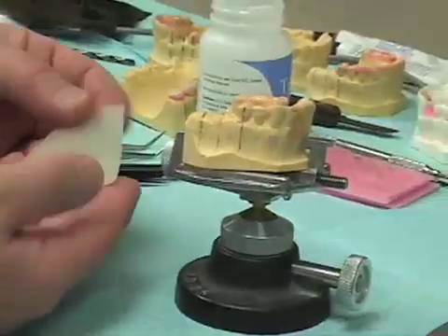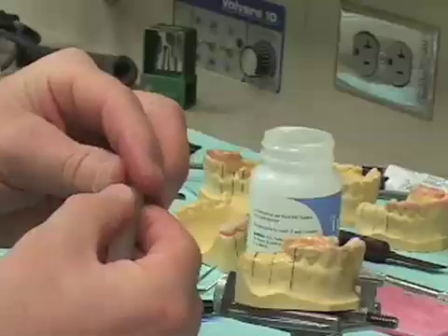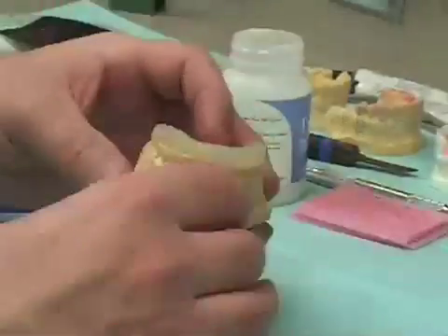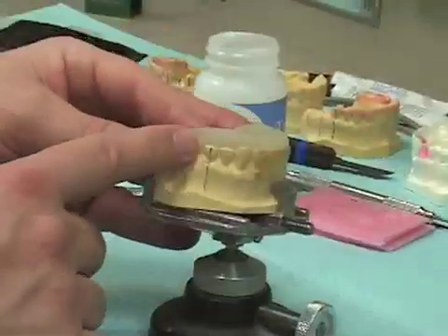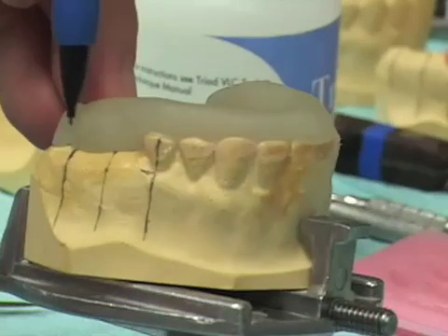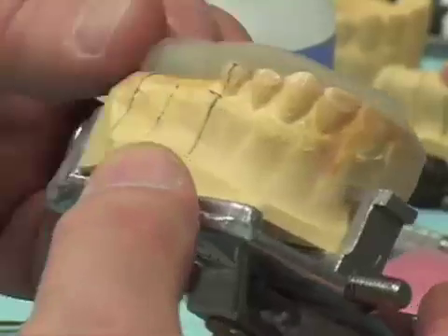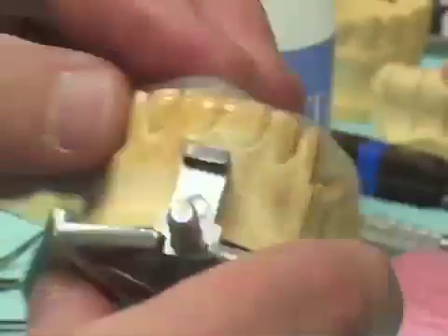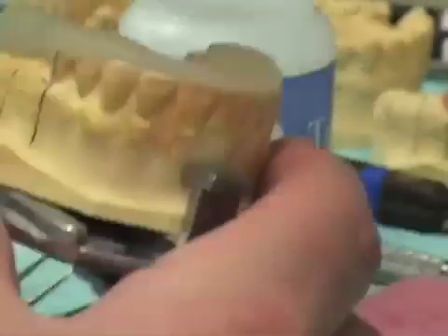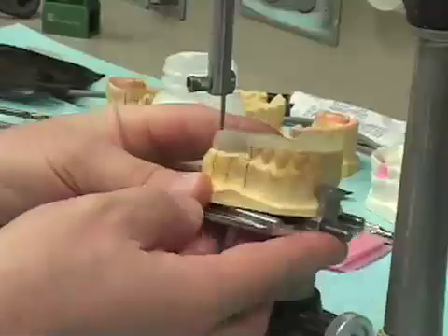With the triad material, I fold it and then literally roll it in my hands making an oblong rope. I then place it on the occlusal surfaces and orient it so that it comes far enough back to go past the area where I want to place both implants. I press the triad down on the occlusal and incisal surfaces of my model — not trying to wrap it over the buccal or incisals. I then bring my surveyor in, brace the triad at the lingual side, and press my surveyor rod into that area.